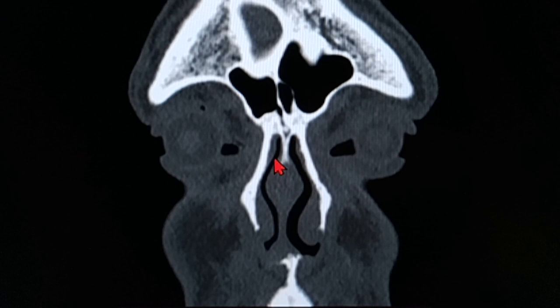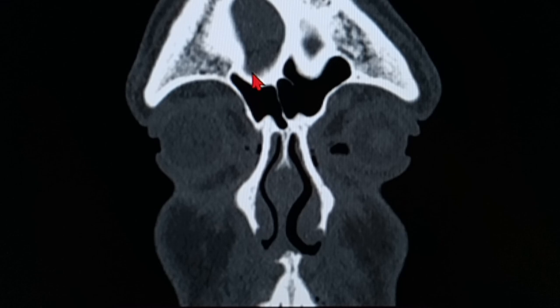Going behind, and now what I can see over here, now this is brain, okay? Now this has to be brain because this is a soft tissue and this is iso-intense basically. So this is the eye, that's the eye, that's the brain coming in the picture right now, and the bone is going to disappear completely. Still the same structure, you can see the maxillary area over here. So keeping on going behind, you can still see the frontal sinus now, the right and the left frontal sinus, the nasal process, the frontal process of the maxilla, and this is the maxillary bone, and then this is the brain. As we know, this is a brain.